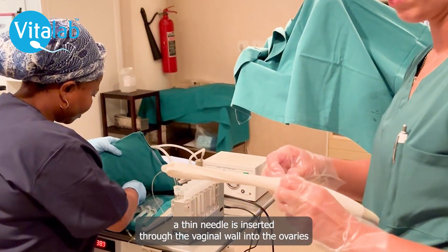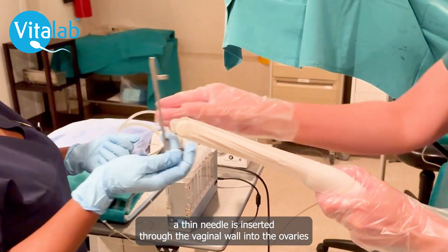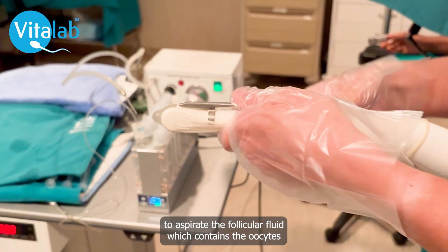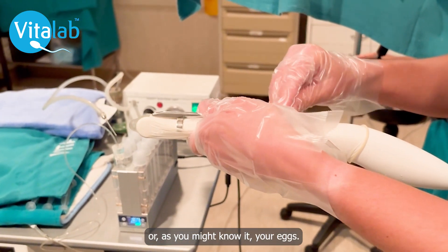Using ultrasound guidance, a thin needle is inserted through the vaginal wall into the ovaries to aspirate the follicular fluid which contains the oocytes, or as you might know it, your eggs.